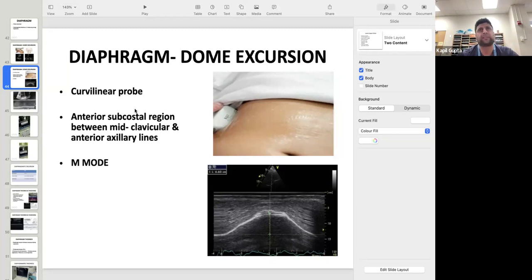Very good question. I think it's just about practice. The more we practice, the better it is. How I became better at this is I did research on this, and I had done almost 50 to 100 scans. Then I realized I became good at it. But it's all about those basic movements of the probe, that is tilting, sliding, and rotation of the probe. I think that is what helps. I would say no particular trick and no particular way of doing it. It's just you place the probe there and then move around that place.